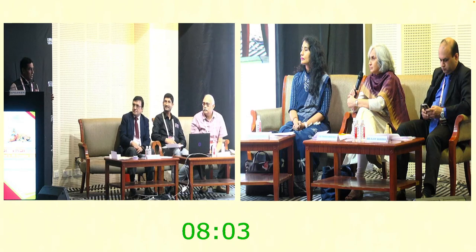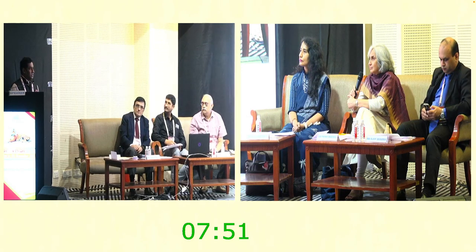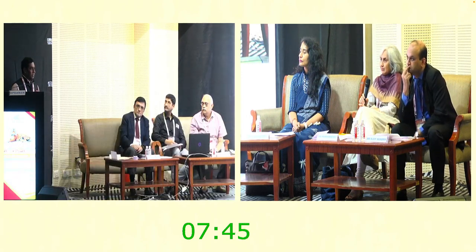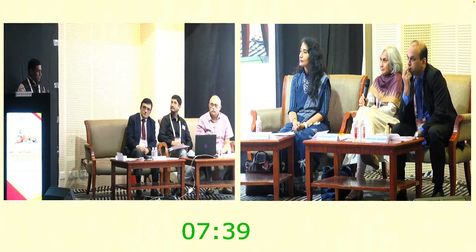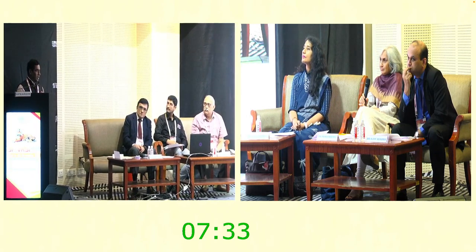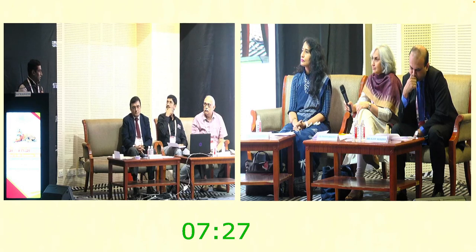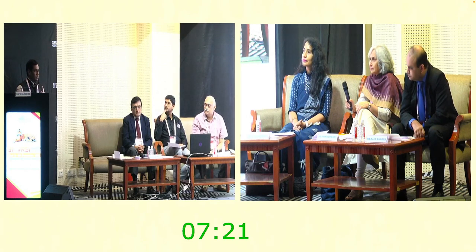The basic difference I would like to highlight, because there is a similar presentation in this session also. There are five differences between the previous presentation and mine. First, they have used it in combination with anti-VEGFs. Second, they have done a paracentesis. Third, they have used a malleable plunger, which is metallic in my case. Fourth, they have given it in the supratemporal quadrant, I have given it in the inferotemporal quadrant. Fifth, they have given it bevel down, and in our case it is bevel up. So to answer your question, we have not done a paracentesis.